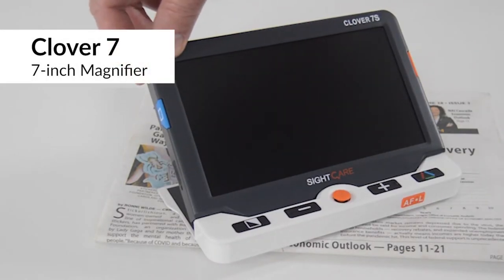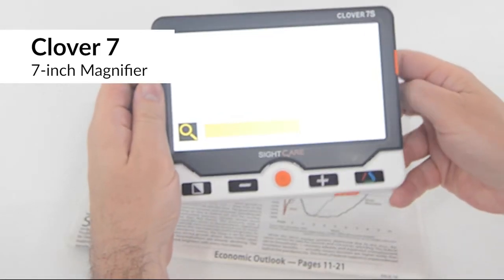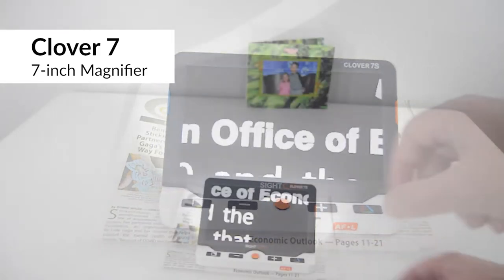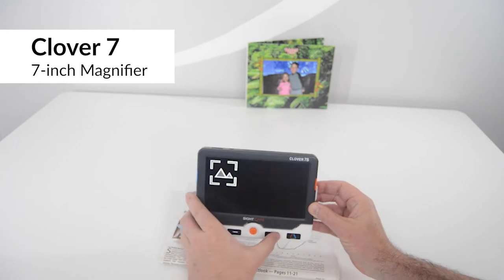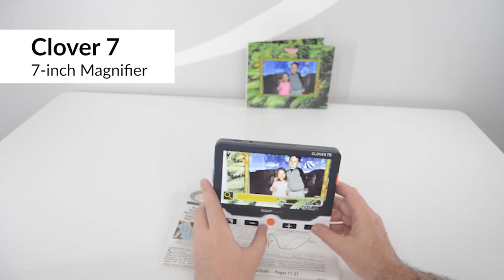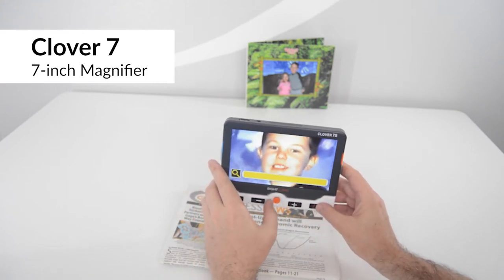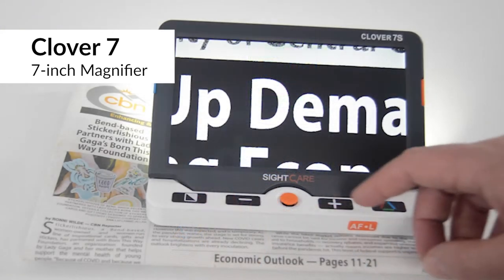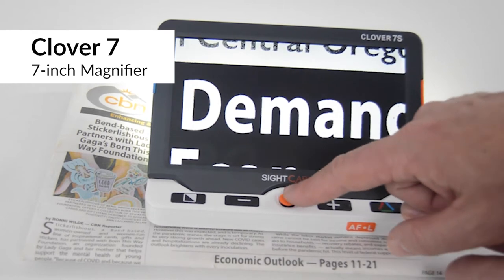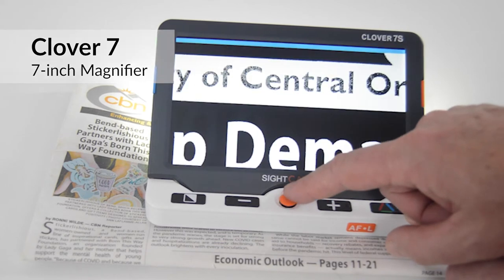Clover 7 has a large 7-inch diagonal HD screen to provide a larger reading area. If you'd like to read at a table, extend the reading stand and read comfortably. Or if you'd like to see something at a distance, fold in the reading stand and the camera switches to distance view automatically. Clover 7 has a joystick that permits you to pan around and view the entire magnified image under the camera, so it's not necessary to physically move the device as often as with other magnifiers.